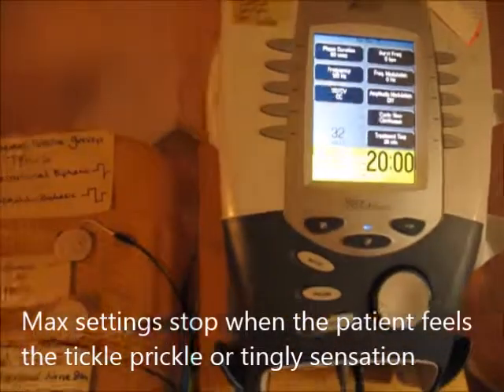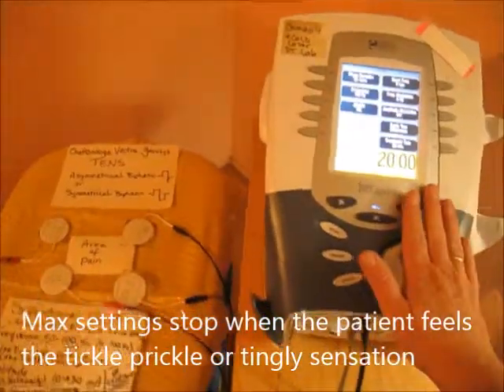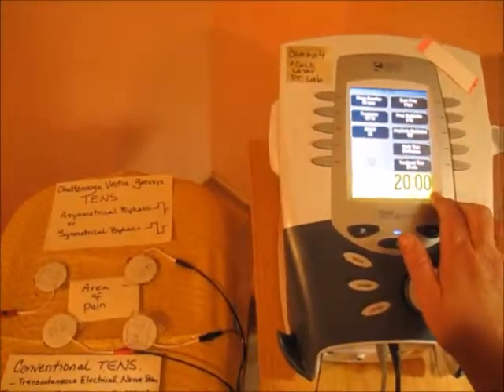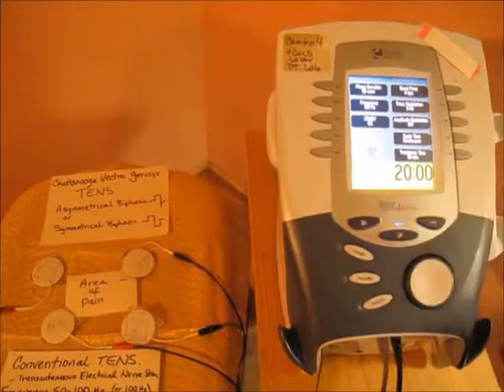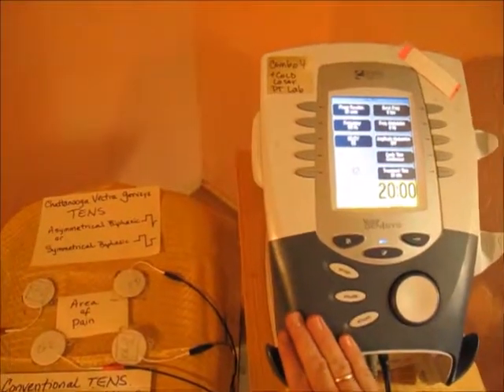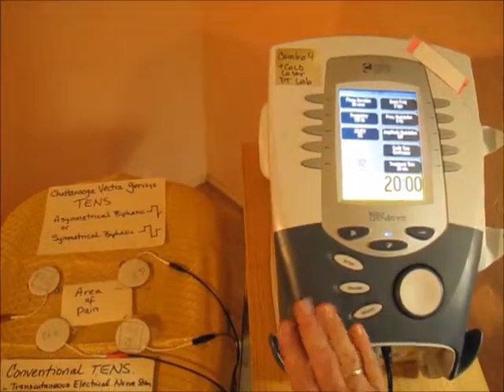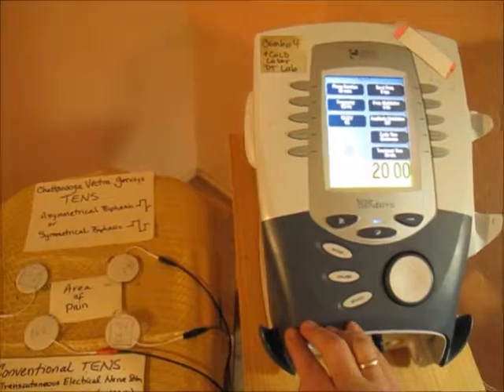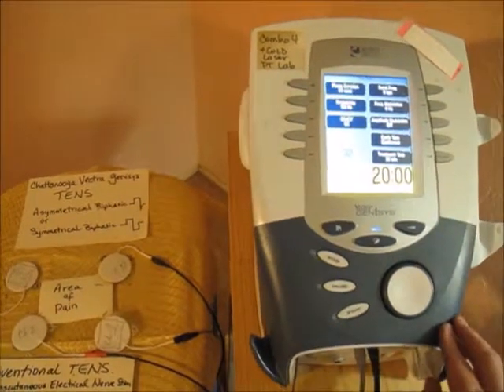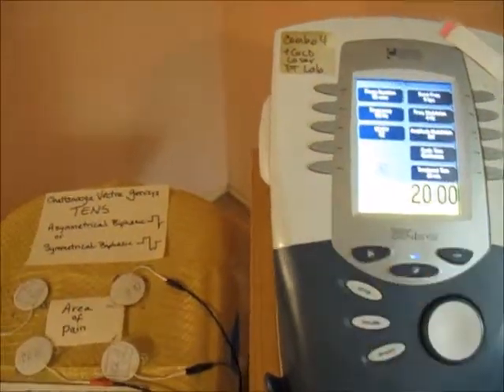That is as simple as it is to use TENS — it is a really neat thing that this unit gives you the option to do. Do a 20-minute TENS treatment before or after your treatment, calm that low back down, and it is a great drug-free way to get rid of pain. And that is it.